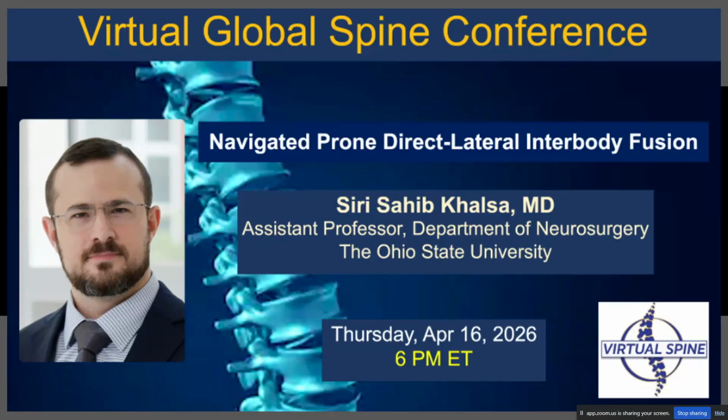Yeah, I often leave a thin rim back there as well, just because you don't want CSF any time when you're doing these. But if you do have navigation, it can be enormously helpful for these cases. I don't always do them with navigation, but I think you just got to. It is a good technique, and I think the ability to simultaneously control the posterior side and access the anterior space is gold. So I've really enjoyed doing the handful I've done so far. And certainly it sounds like you've got the experience to make the jump.